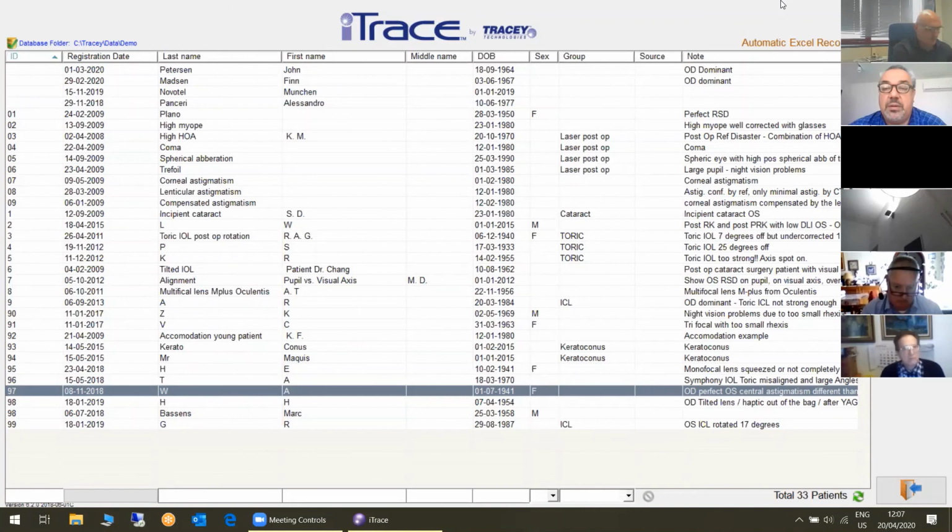So if we acquire a wavefront with Hartmann-Shack with 5 mm of diameter, it is not correct to estimate the wavefront behavior for the smaller pupil. And with Tracey, this obstacle is completely passed.